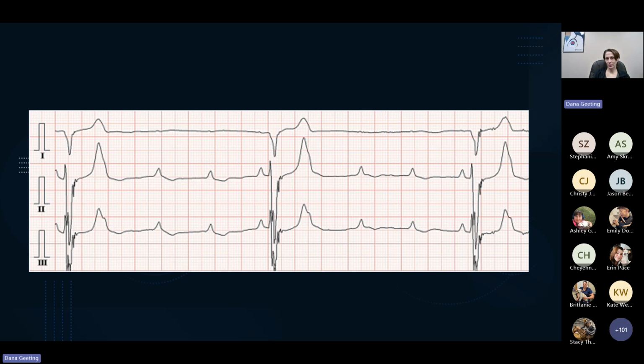All right. So here, this one looks a little funky. Here you're going to want to mainly look at lead 2, which is going to be your middle ECG, because anytime you're interpreting, you're always going to want to use lead 2. So in lead 2, almost close.